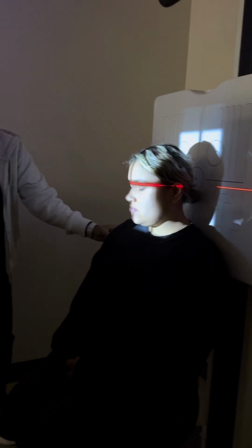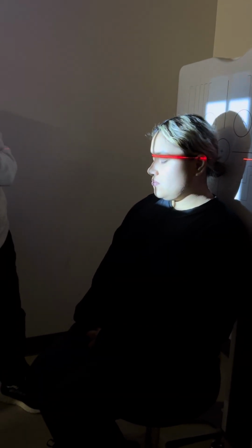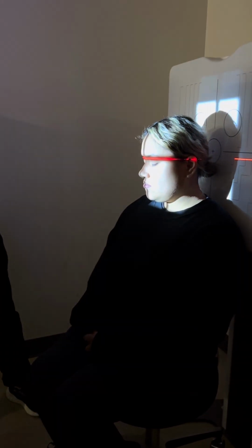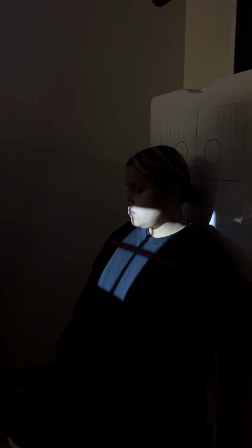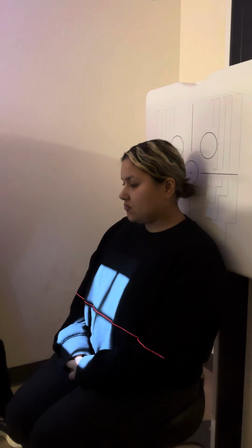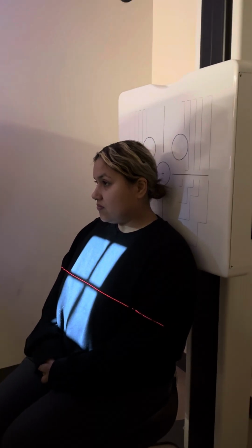This changes from doing the skull, which is 2 inches above the glabella. We know that. But when we do it, it's actually 30 degrees caudal angulation. When we do it for facial bones, we're actually looking at the zygomatic arches. What typically has happened is somebody got punched in the face, and they've blown out that portion of the orbit, which actually happens to be our cheekbones.